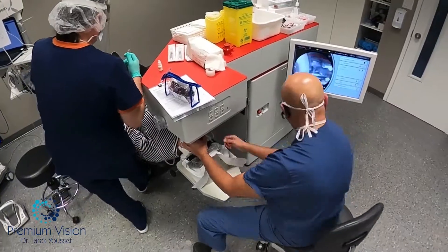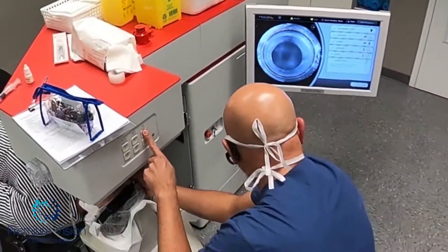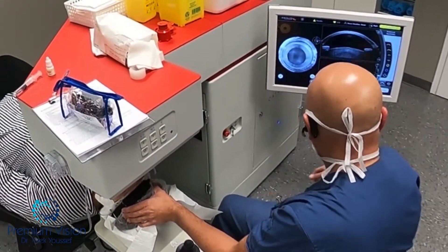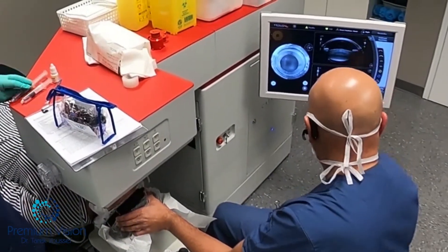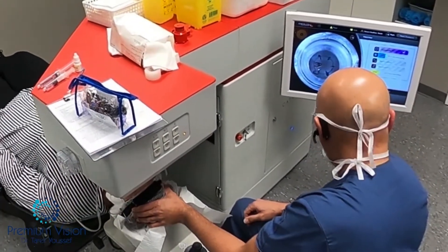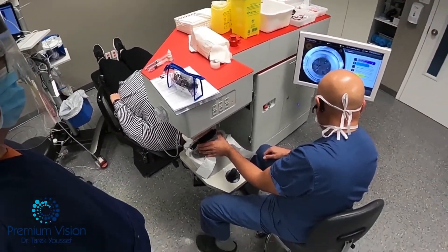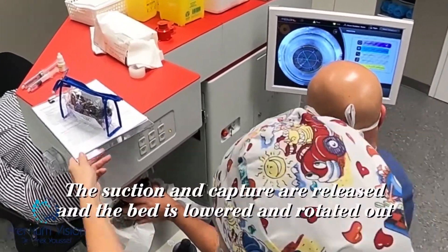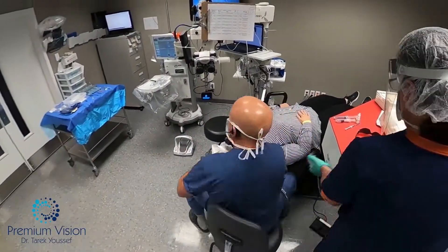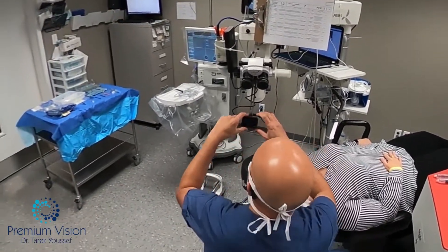The technician filled the chamber with BSS, raised the patient's bed to the level of the laser lens, captured, unlocked, scanned, and passed through the stages of the laser. Once done, the suction is stopped and the bed is moved out and raised to the level to do the cataract surgery.